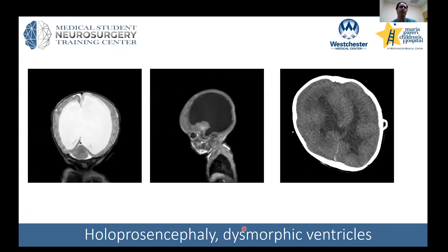Not all patients have normal ventricles. This is a patient with holoprosencephaly, where some midline structures do not fuse and there is really just one large ventricle. This exists on a continuum. Here is an example of dysmorphic ventricles that look very abnormal, and you can tell this patient has a shunt — you can see the valve on the side.